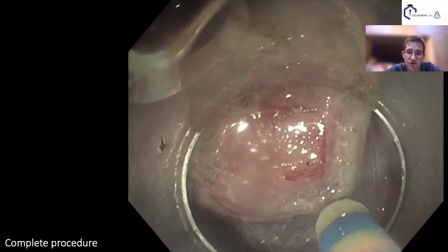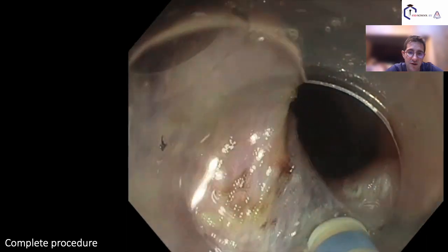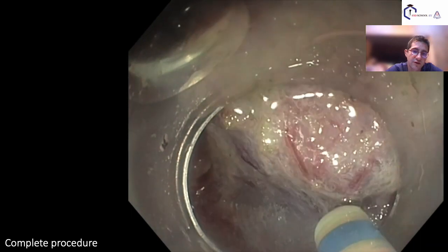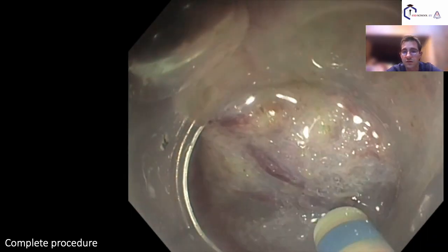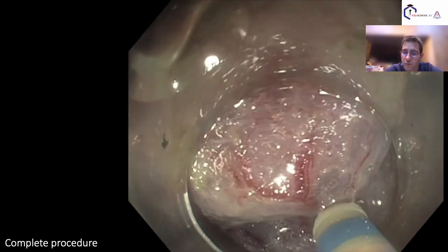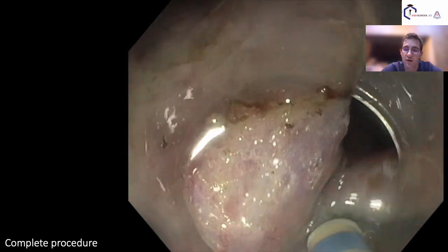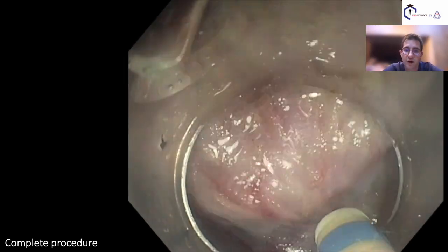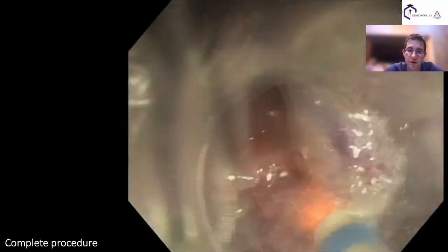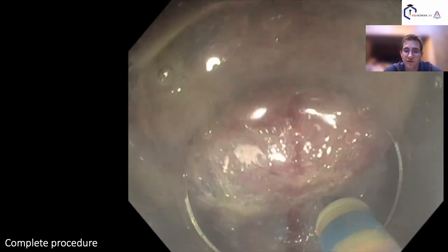And in fact with this kind of device we increase our speed in between 2 times and 3 times depending on the lesion, but when it is an easy lesion the speed is really increased a lot in our series, and it also allows to deal with very difficult lesion like appendicular ones, ones in the ileocecal valve, or for example in diverticulars or fibrotic areas, or all this ESD that were quite impossible, and thanks to this very strong traction that is adaptive when you need, it makes this difficult case feasible.